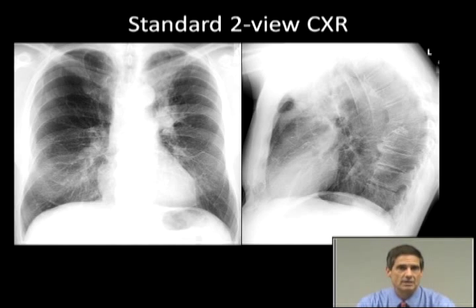Those are good things about a standard 2-view chest, and if you have the option of having a standard 2-view upright chest in the department versus a portable, you always want to take the option of the standard 2-view chest, if you can, just to get a better image.